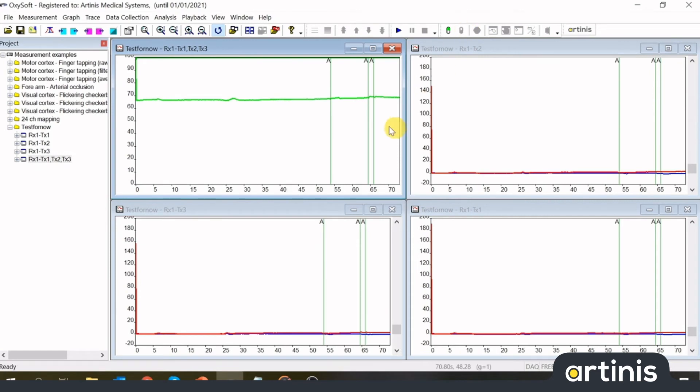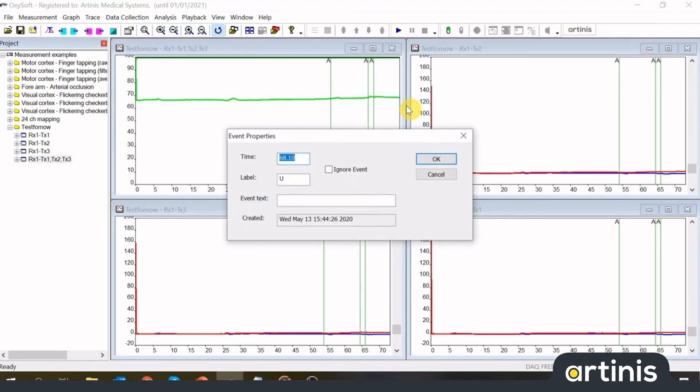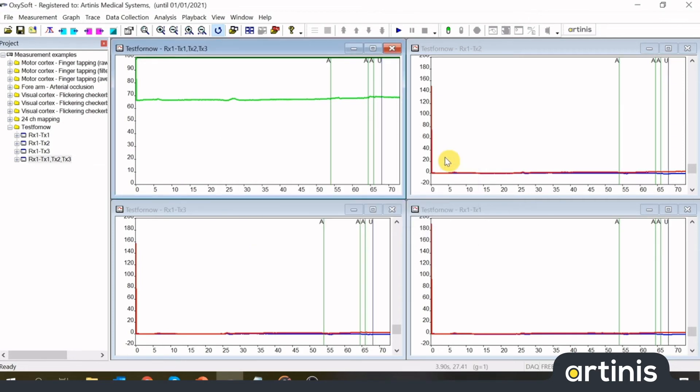Inserting an event after measuring is also possible. Right click in the graph at the time coordinate, and select Insert Event. In this window you can change the time coordinate of the event, the event label, and the event text if you prefer.